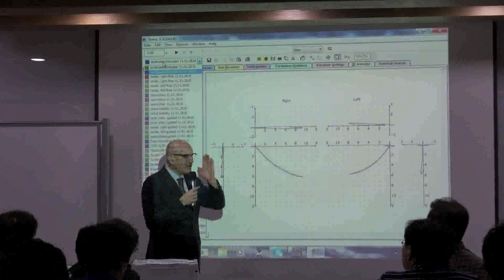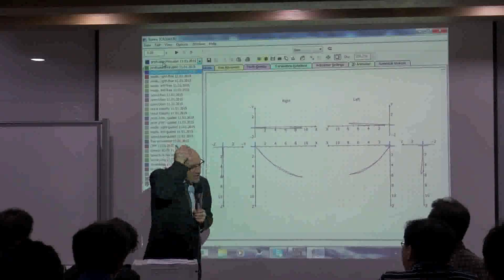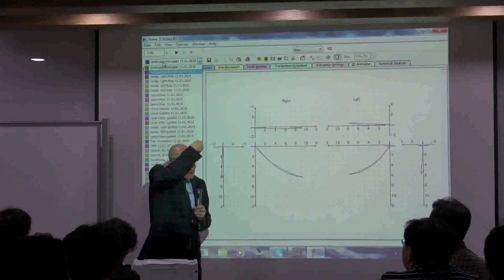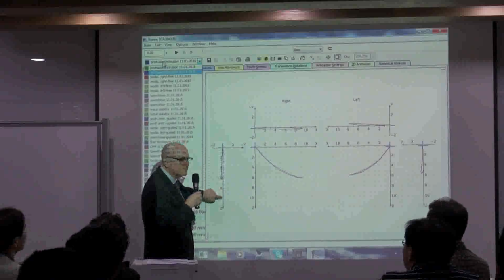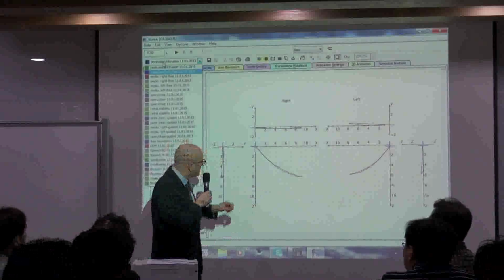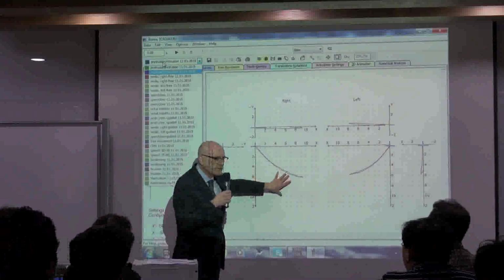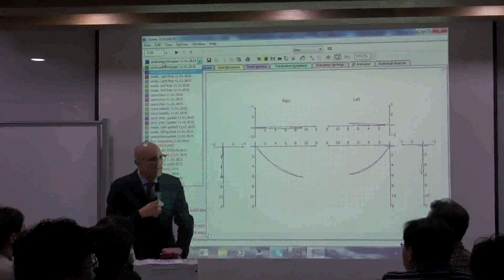Protrusive movement is strongly, highly symmetric, always. This is neurological reason, brain. The muscles are controlled bilaterally by the brain. So there is always checking. Healthy protrusive movement is always on zero line. If we see separation in and out, we know loose ligament, too much mobility left and right. And we can see a little separation here, up and down, we can see loose ligament in this one. So this is the confirmation something is wrong in the joint with the ligaments.